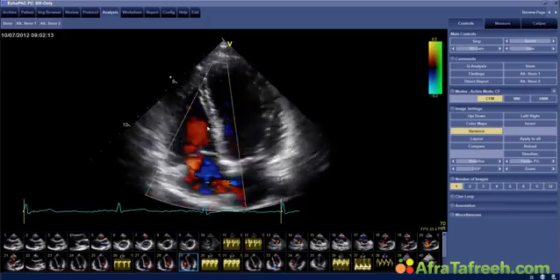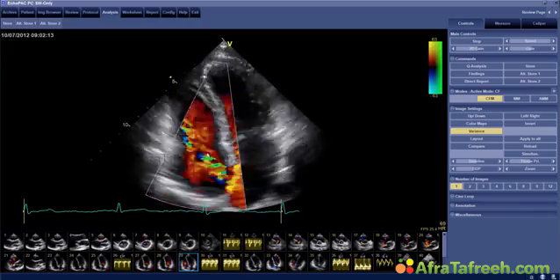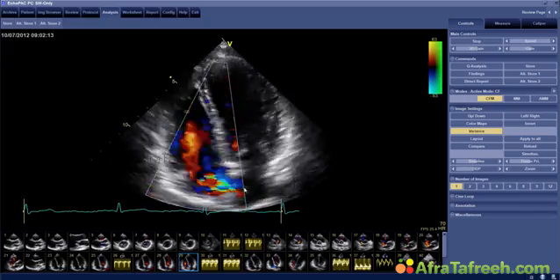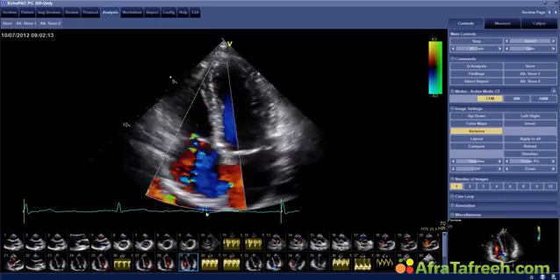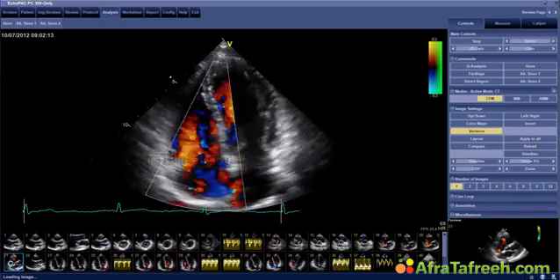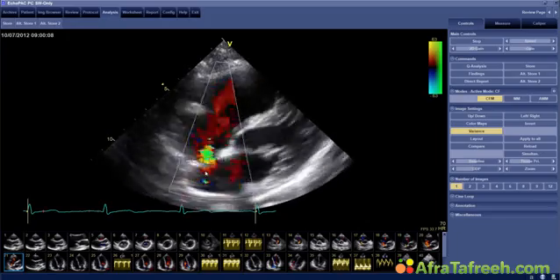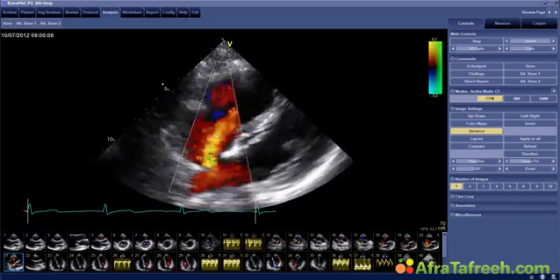If you look at the tricuspid regurgitation, you should also see that there is a jet from the left atrium to the right atrium. This is an atrial septal defect. You should pick this up. Of course, you can use an image view which helps you look at the atrial septal defect even better. This is a slanted view where you see the jet very nicely here.